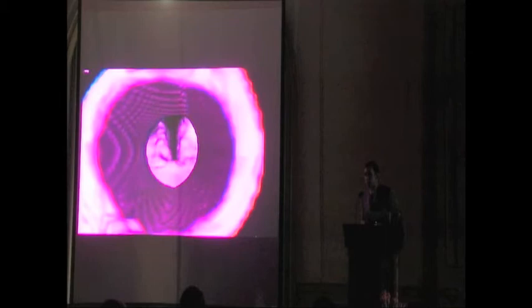You can move the tube down to get a little bit of exposure downward. If you want to get the disc, you can move it up to get the nerves decompressed above and below where you're working. So you're not locked into a particular position — once the tube's in there, you can actually move it around and get a better look. You can also rotate the tube to give you a better view.